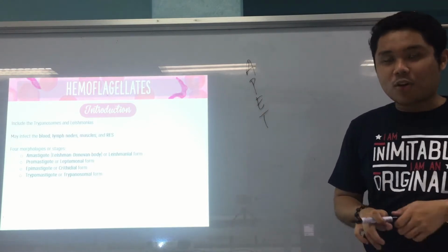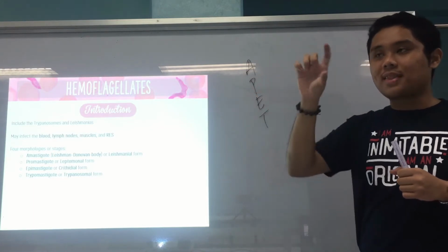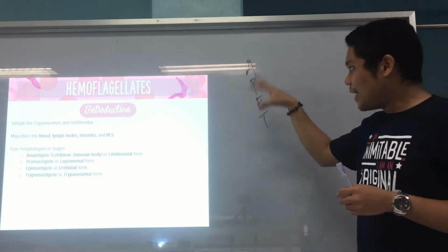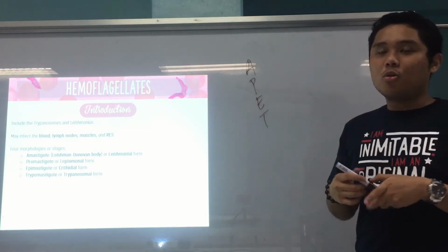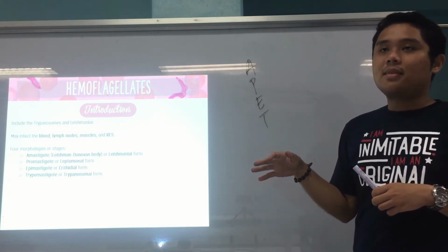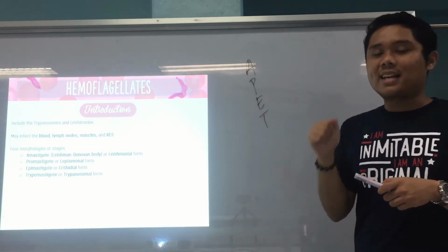But not all of your hemoflagellates follow this order of stages. And not all of your hemoflagellates have all of these stages. Only some, I think Trypanosoma cruzi, exhibit all of these stages. The rest of your hemoflagellates only have a combination of these stages, but not all of them. If I'm not mistaken, yes.